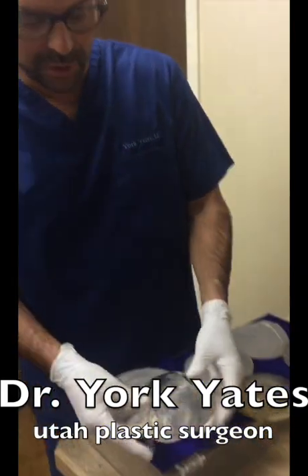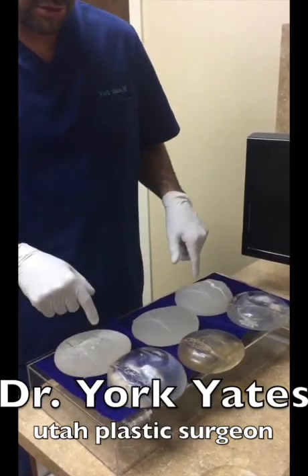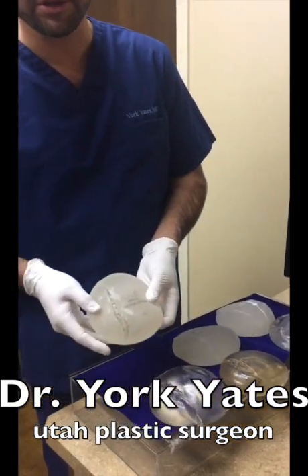There's quite a difference between cohesive implants and less cohesive implants in their ability to hold their shape, which is why teardrop or gummy bear implants have to be made out of a more cohesive, firmer, stiffer silicone.